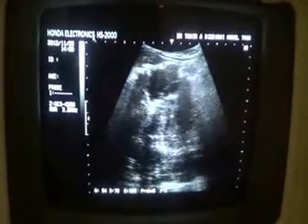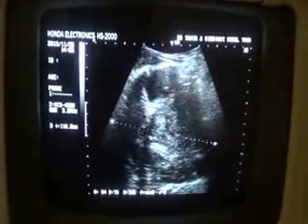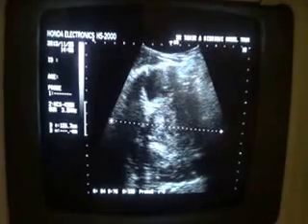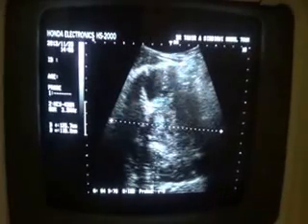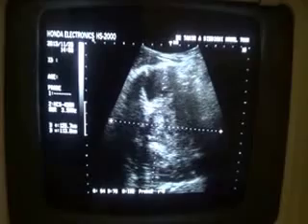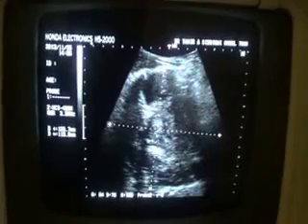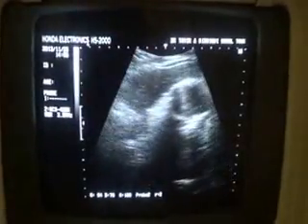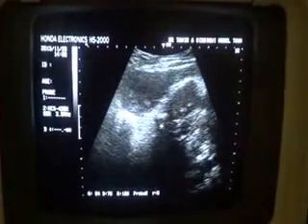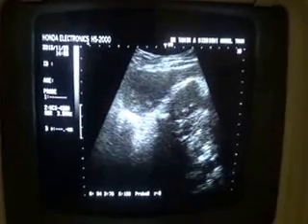So now this is the pelvic mass. Here it measures. This will be an accurate measurement now. Approximately 10.5 by 11 by 3 centimeters, and it's complex, cystic and solid, because you can see that there are a few cystic areas scattered. These are all cystic, these are tiny calcifications, and now this is the uterus. This is the fundus of the uterus, and the lower segment, and the mass. This is the mass.